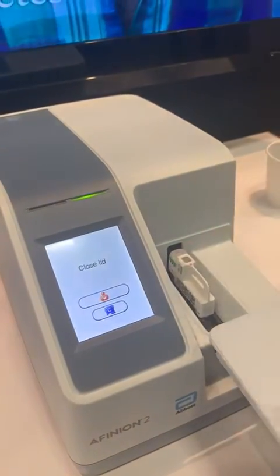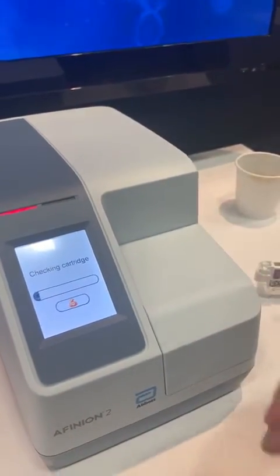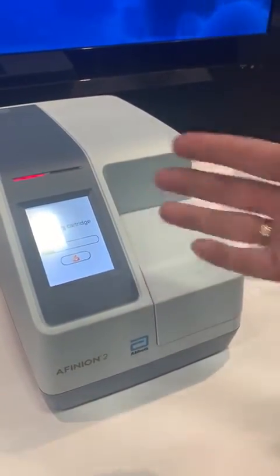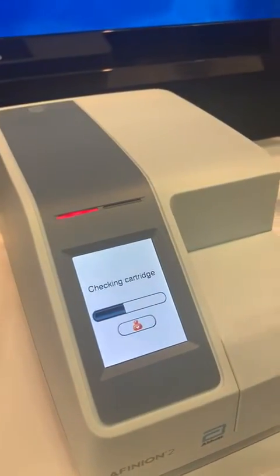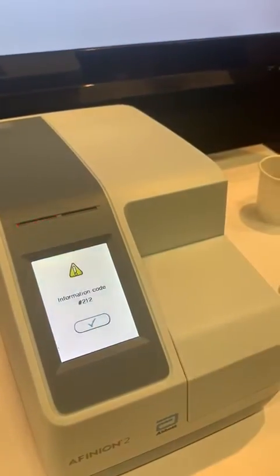Place it like this, and then it will test. It will give me an error because there's no sample. If there was a sample, it will take 3 minutes and give you the result on the screen here. So it's 3 minutes.